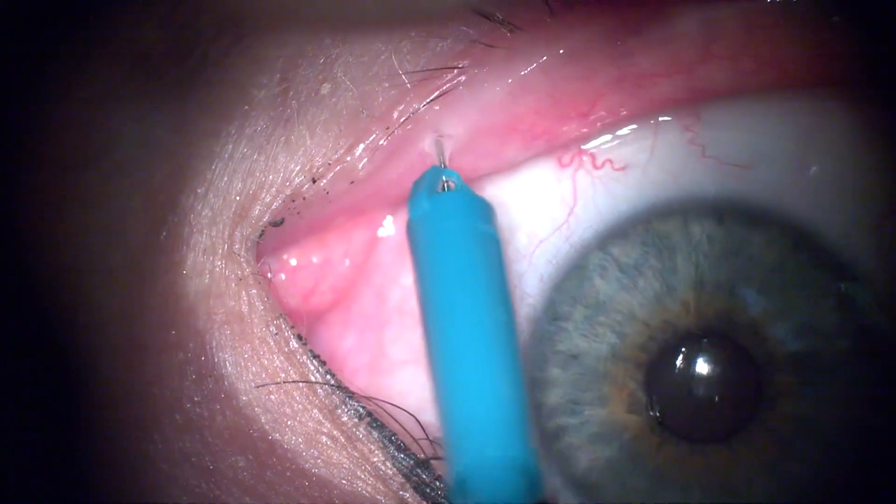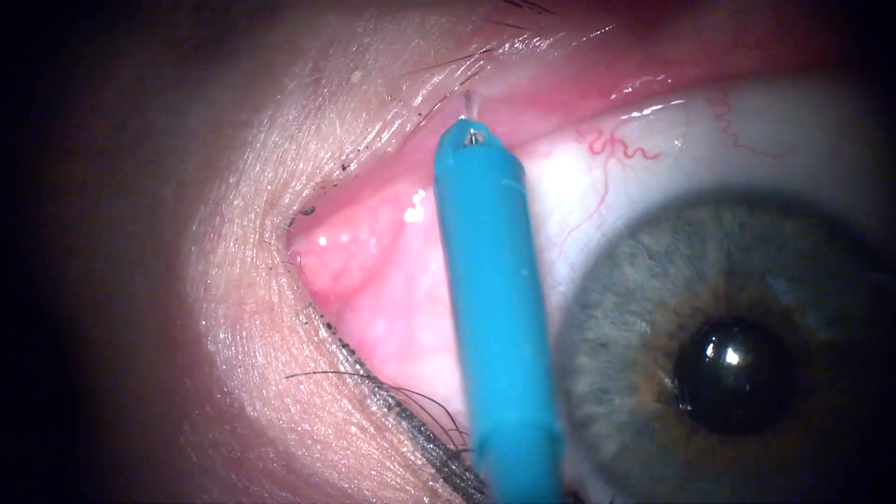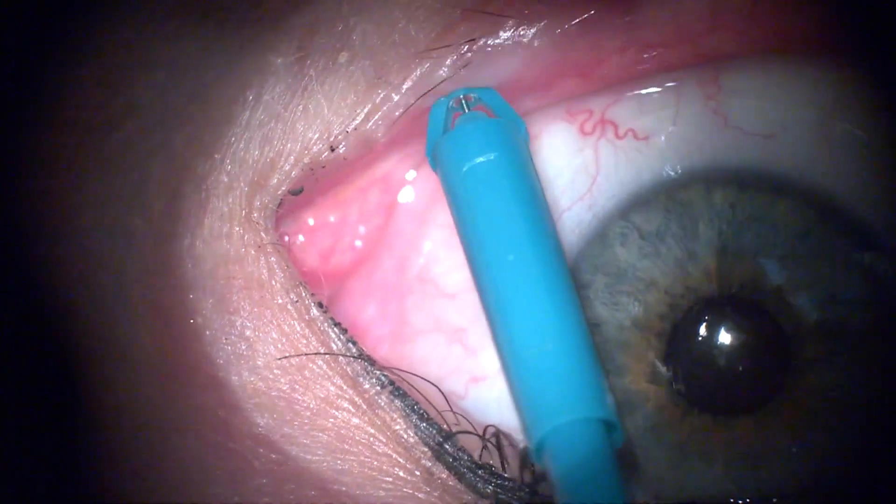Insertion can be carried out with the patient in a seated position with or without a slit lamp.